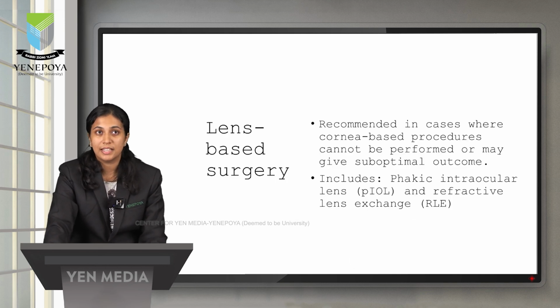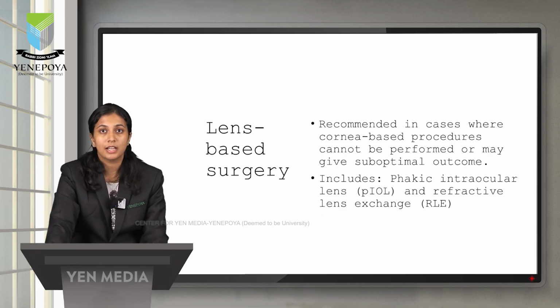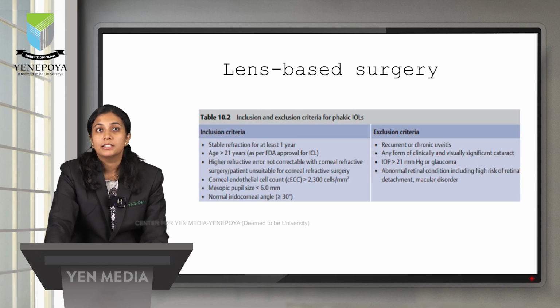A short note on the lens-based procedures. There are mainly two procedures: phakic intraocular lens implantation and refractive lens exchange. In phakic intraocular lens implantation, you keep an intraocular lens over the crystalline lens, while in refractive lens exchange, you exchange the crystalline lens in the eye for an intraocular lens. The difference in the inclusion criteria here is that the age should be more than 21 years, and they should have a normal corneal endothelial cell count of more than 2300.